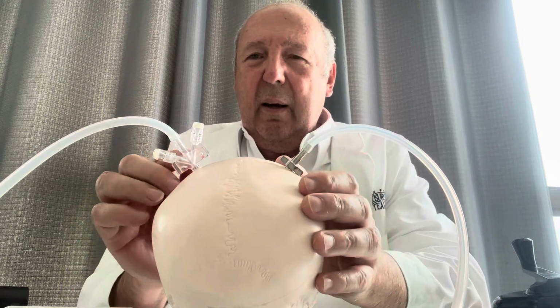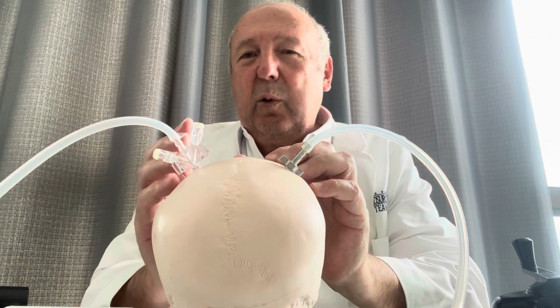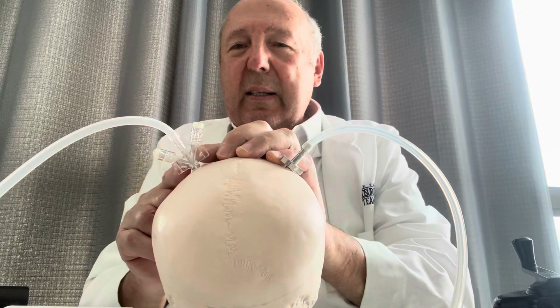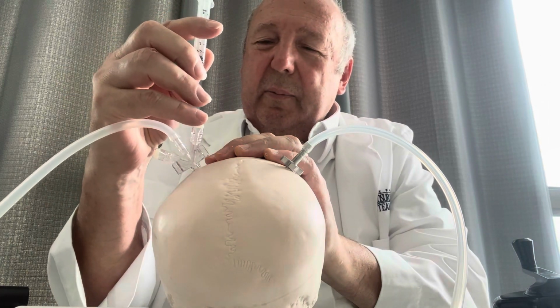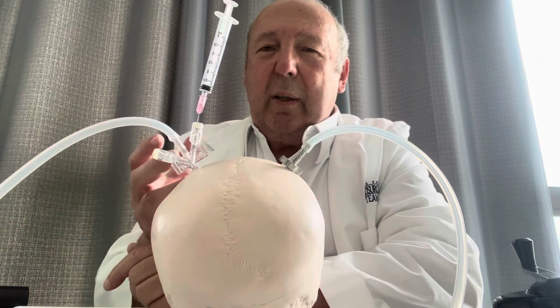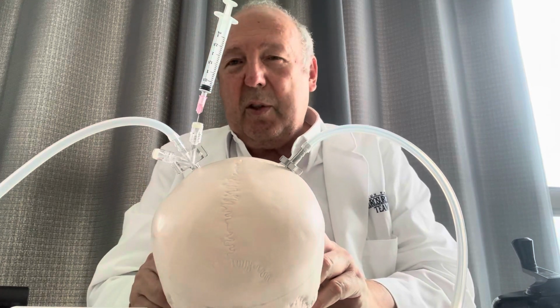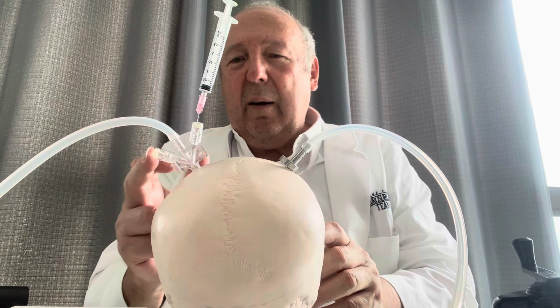Another difference, as you can see, the NASP is transparent. If there is, say, a clot obstructing the lumen of the port, with the NASP, you can see exactly where the clot is. And the NASP has needle access. Therefore, one can use a needle and enter the lumen of the system and inject, if desired, a thrombolytic agent to break the clot. Through this access, one can also aspirate the subdural collection directly from the subdural space and can also irrigate the subdural space, irrigating from one side, aspirating from the other side.